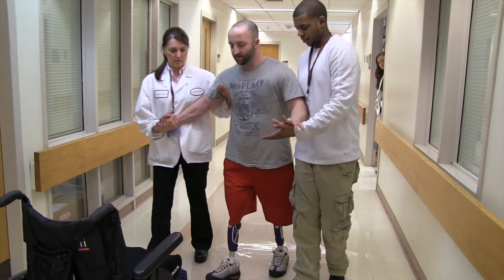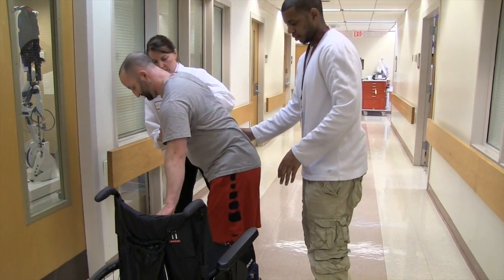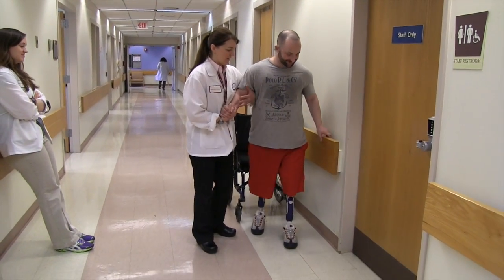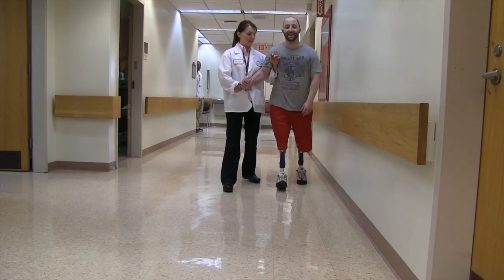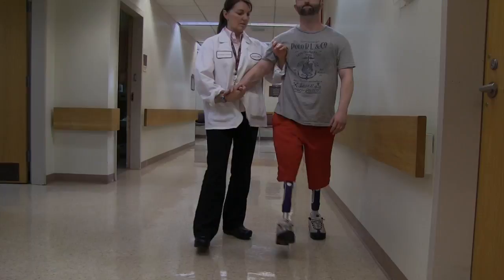Do it nicely. I feel fine. Legs nicely. Great. Excellent. Great. Good.